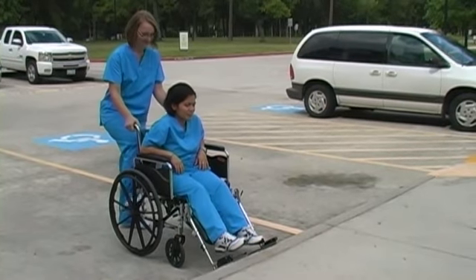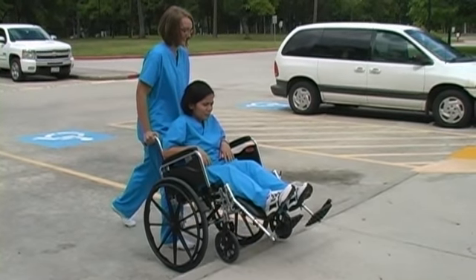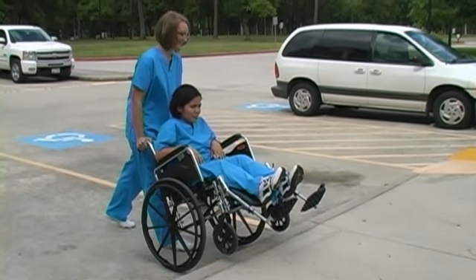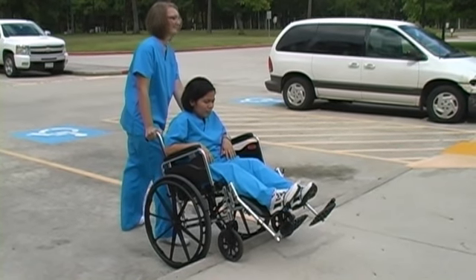For assisted wheelchair going up a curb, place your foot on the tilt bar and push down while pulling back on handles, tilting the wheelchair backwards. Move the wheelchair forward and place the small front wheels on the curb.